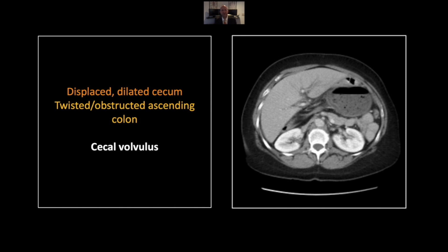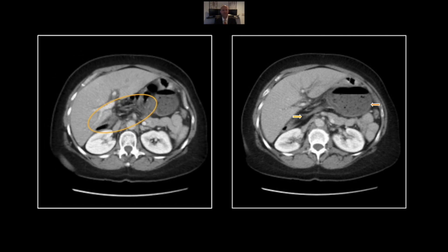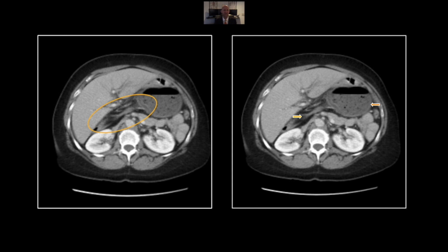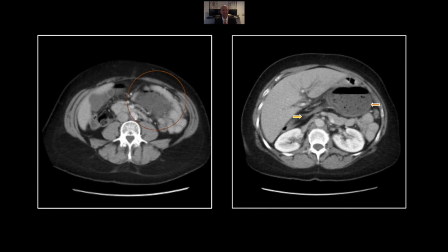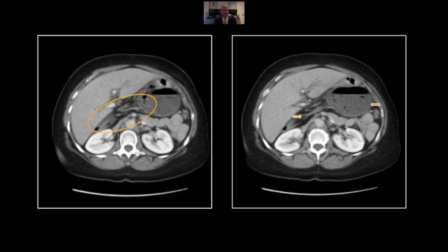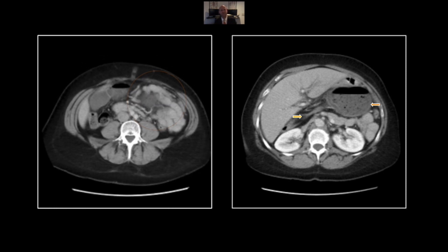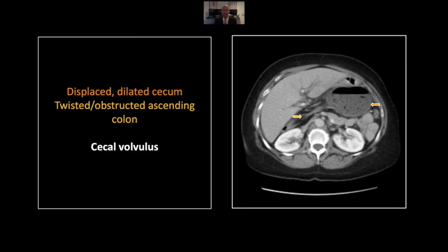Our next case is a cecal volvulus, but an unusual one. You are looking at the cecum here in the left upper quadrant — it has herniated across the midline through the foramen of Winslow. You can see the twisted length of ascending colon passing right through there, just above the level of the first portion of the duodenum. There is the twisted portion of ascending colon, and again the blind-ending cecum there in the left upper quadrant and left abdomen. Fairly unusual hernia and volvulus but a pretty typical appearance of that. That is a cecal volvulus with herniation through the foramen of Winslow.